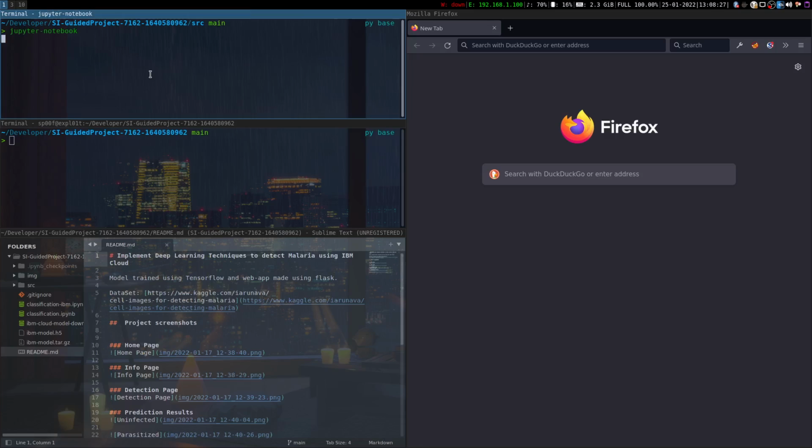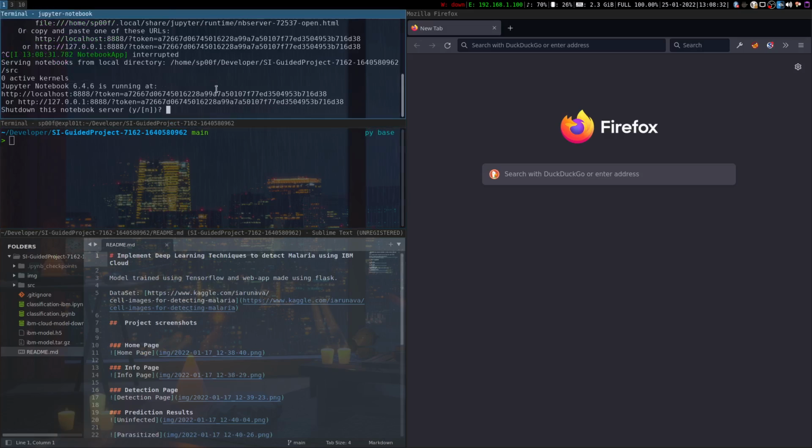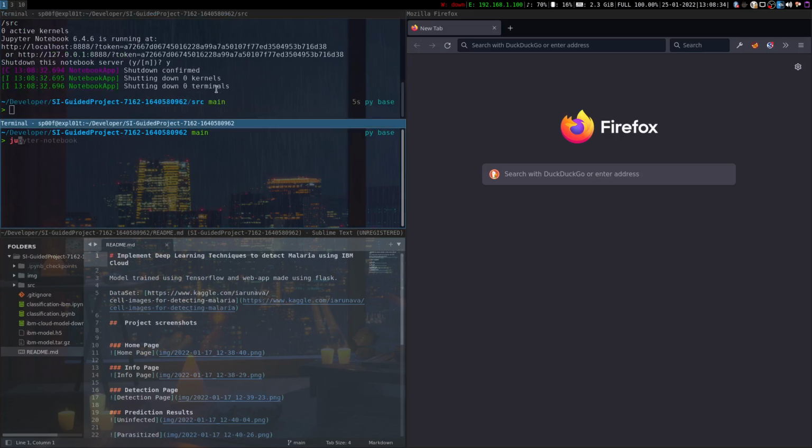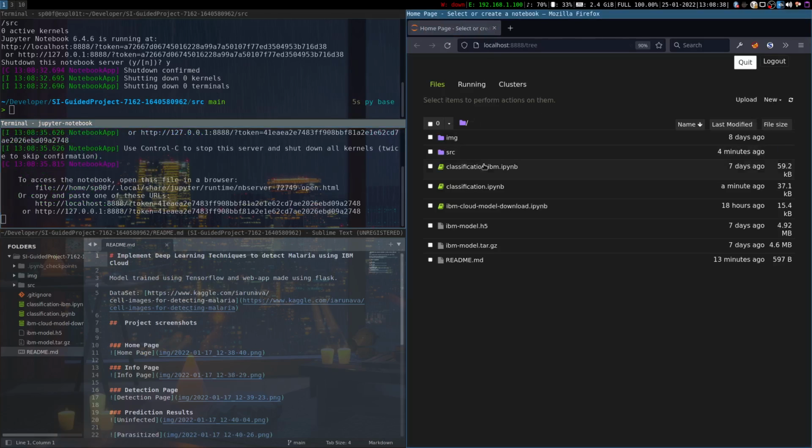Firstly, we'll check out the model which we have prepared.